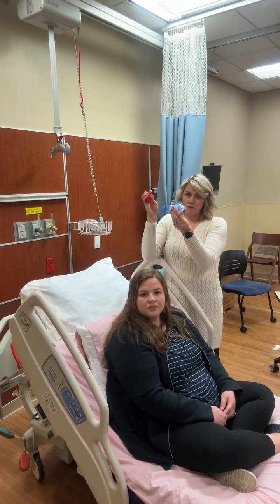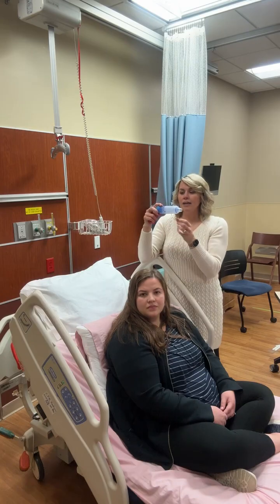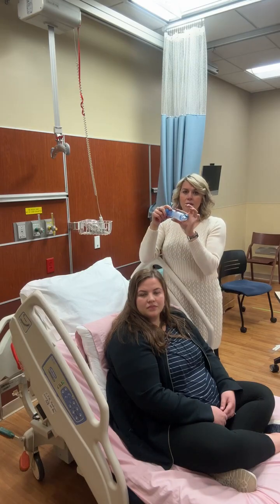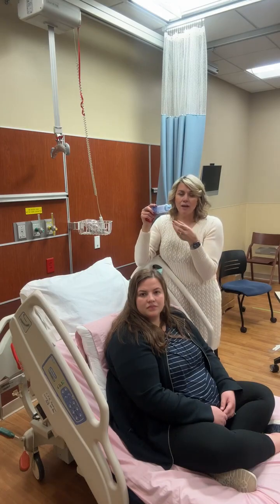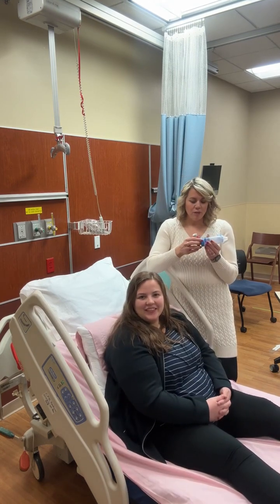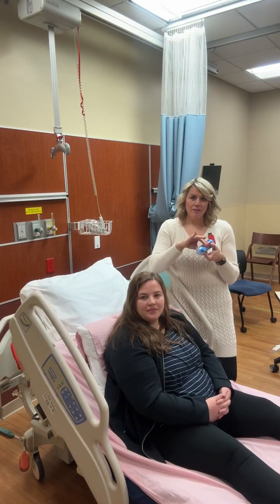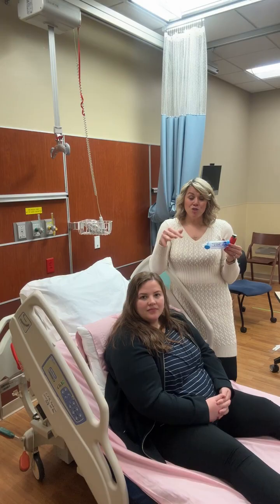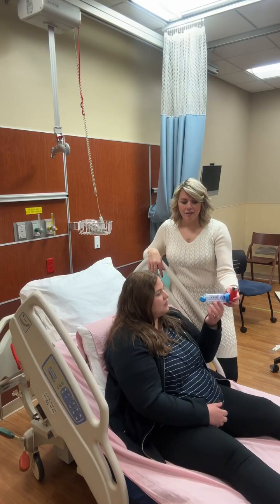So the aerosol from the inhaler is only going to come out of the tube when the patient sucks on the mouthpiece or inhales. Most of the aerochambers or spacers have a mechanism that will make a humming noise if you breathe too fast. With this aerochamber, if they breathe in too fast and too hard, they will hear a harmonic sound, and that is not good. We don't want to hear the noise, so go ahead and simulate that for me.